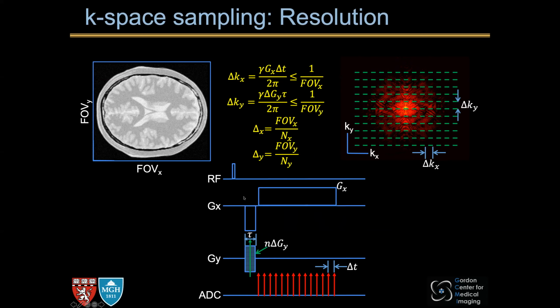Now, to this end, we have accomplished this loop. Given an image object, we know how to design a 2D or 3D imaging experiment to acquire this MR data. We know how to specify all these imaging parameters of the so-called MR sequences.